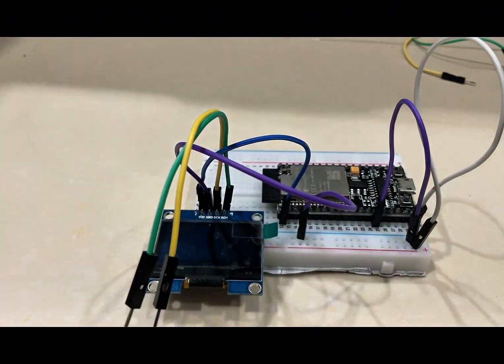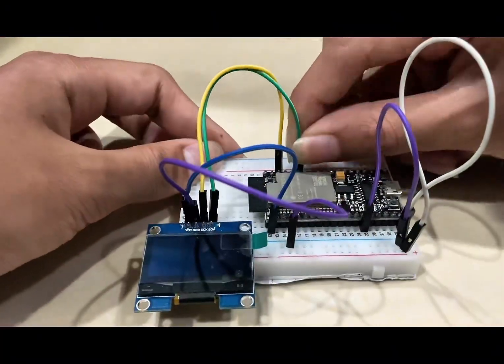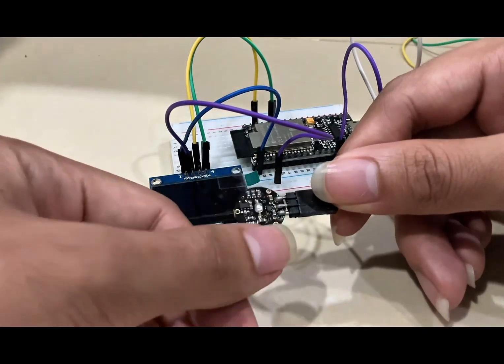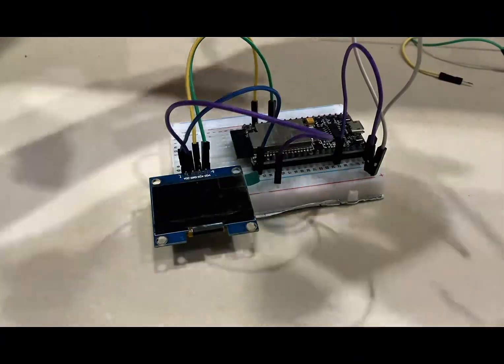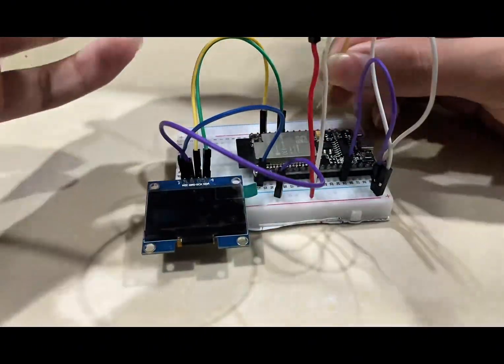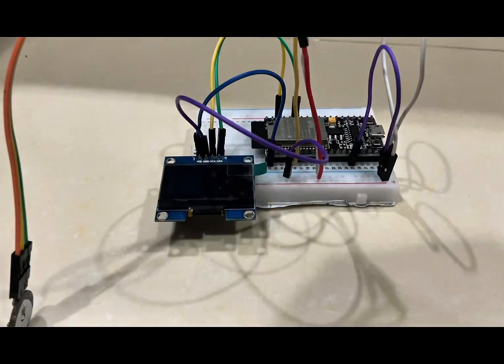For the SDA, we will go to pin 21, and SCL will go to pin 22. Next, the pulse sensor, we have positive, negative, and signal pin. So we will connect the positive to 5V, negative to ground, and the signal pin will go to pin 34 for analog pin.